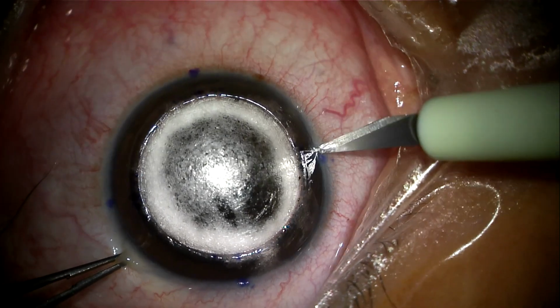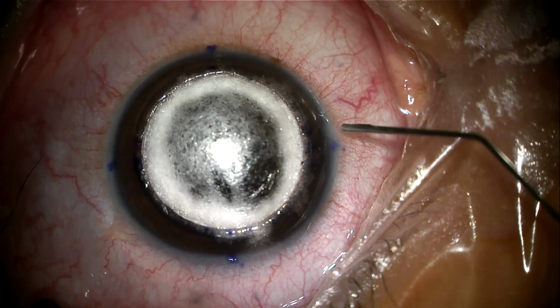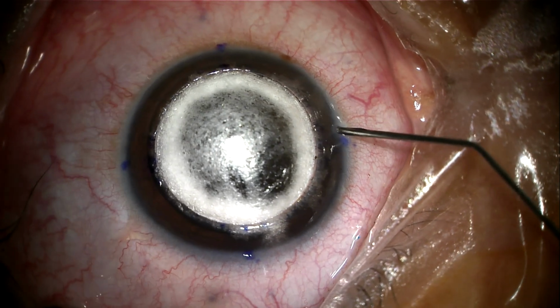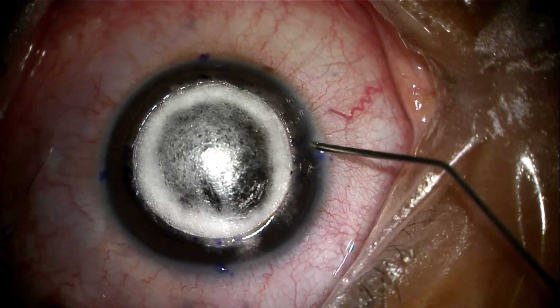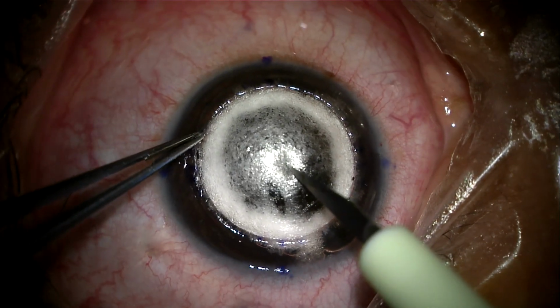Paracentesis is then done to decrease the AC pressure. This can be followed by injection of small bubbles in the AC to confirm the presence of the bubble and to monitor the bubble behavior in further steps of the surgery.